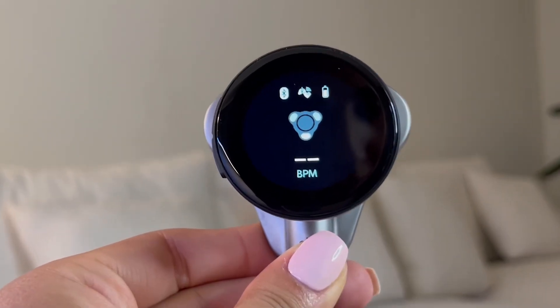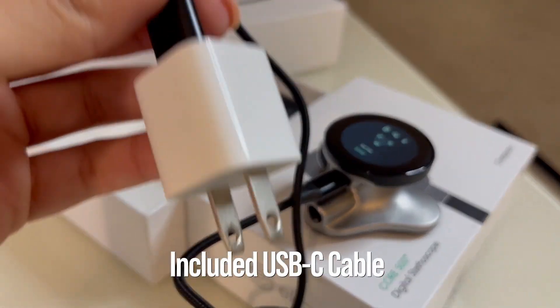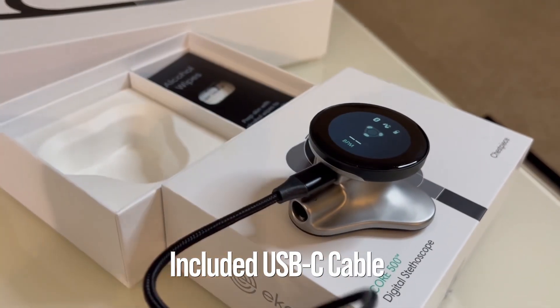The stethoscope's battery life is very impressive, lasting for several days of regular use. When it does need to recharge, you can easily do so with the included USB-C cable.